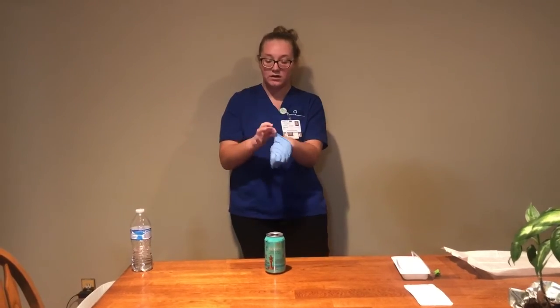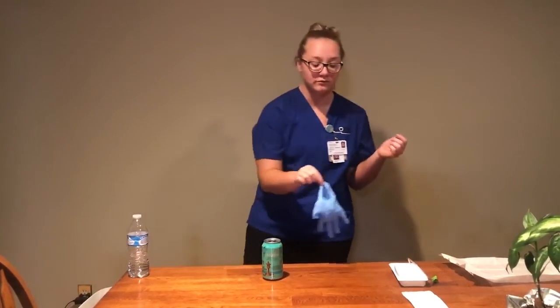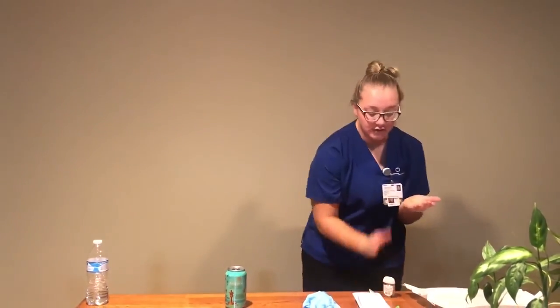So take off my gloves, and then discard them, but I'm going to keep them just in case for later. And then after that, I would wash my hands. I would make sure that my patient is back in comfy position. I would get rid of the towel, the waterproof pad, and then I would document that I did her trach suctioning.